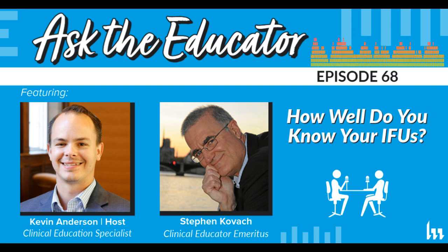So you and I have done audits of decontam and trays, and I go into a department and I see hand washing of these exact cords, and they're not following the IFU. Then I see them go into a tray, and this even says you don't coil it more than 4 to 5 inches, and I see them coiled really tight.